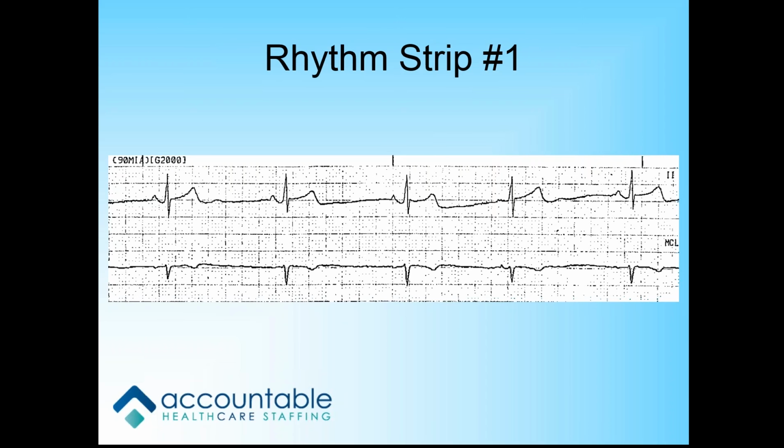I'm thinking zebra, because you're on an oncology unit, so of course you're going to be thinking, what's the underlying cause of this? She's sinus brady and she's sick. You have to do something for her. You could give her some epi.